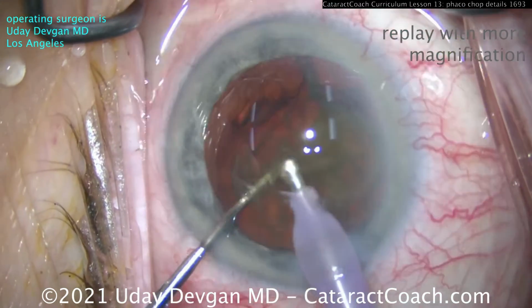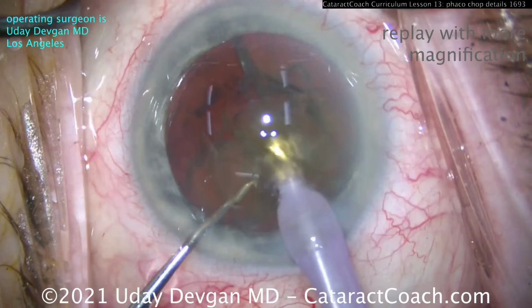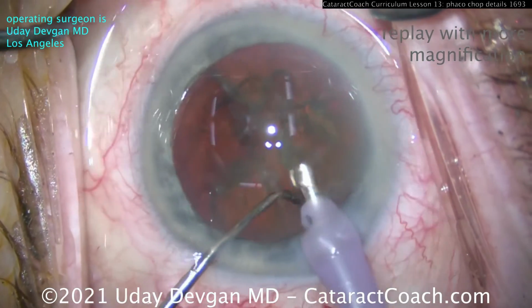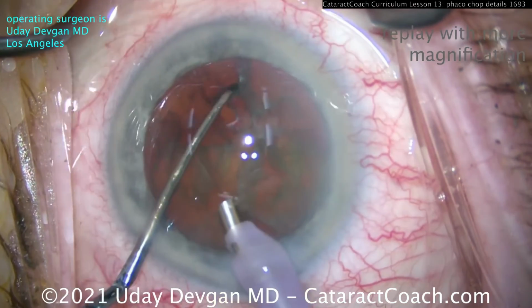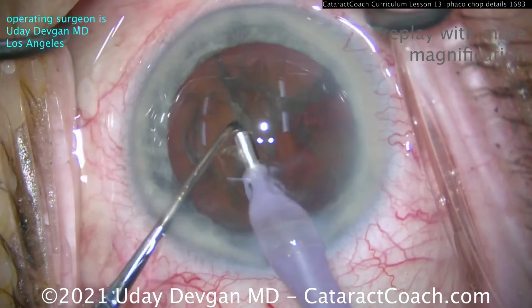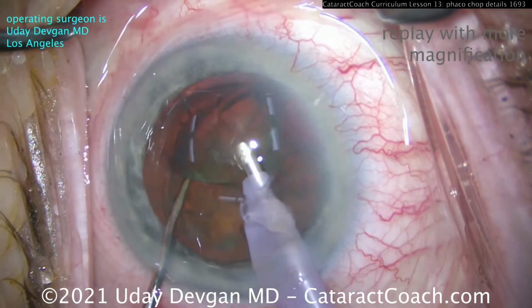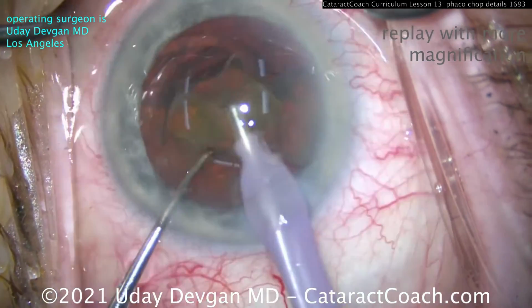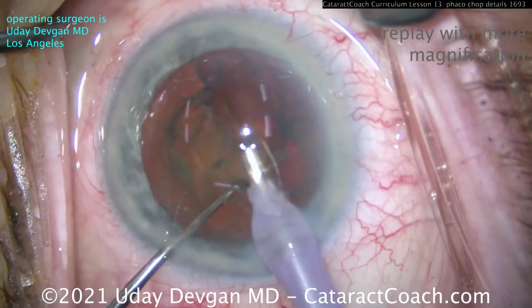This is just a repeat with higher magnification, a replay here, so you can understand the technique. And now, notice how the chopper at this point just pushes the pieces in front of the probe, keeps them in the correct position. So we can rotate it around, let's get that other quadrant out, and then that last half will chop again. So make sure we have good separation, there it is, bring this quadrant up, right about the iris plane. We don't want to ride the endothelium when we're doing this. You want to be just at the iris plane and taking that down.